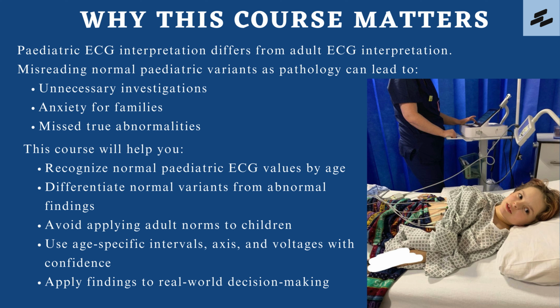At the same time, genuine abnormalities may be overlooked if they are mistaken for normal age-related changes. This course will help you recognize normal age-specific ECG values, differentiate between normal variants and pathology, and avoid the most common pitfalls. Ultimately, the knowledge you gain will strengthen your ability to make safe and confident clinical decisions for pediatric patients.